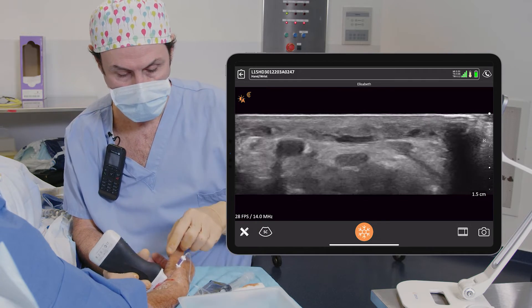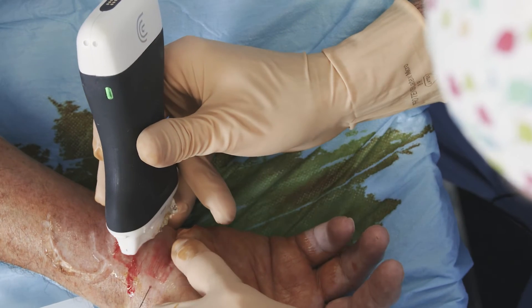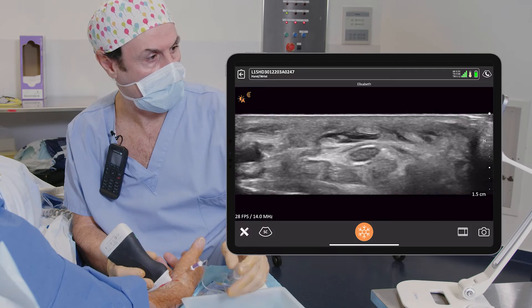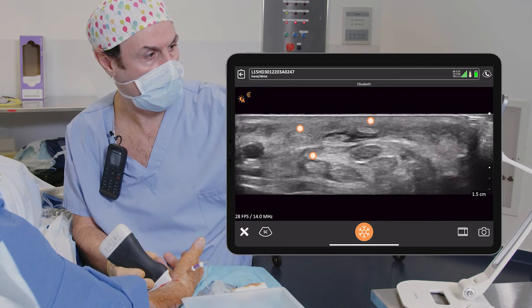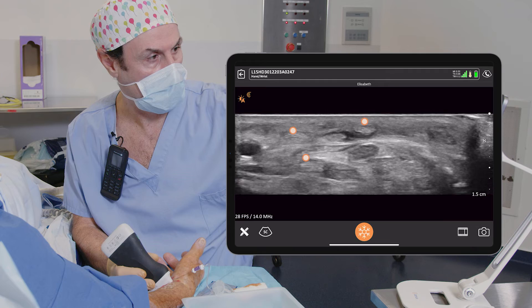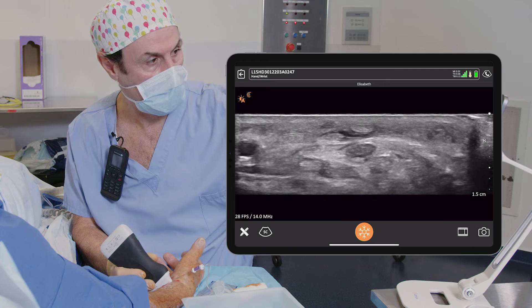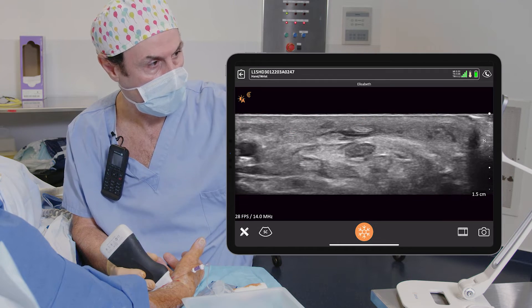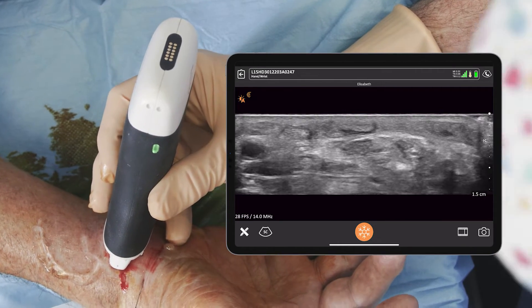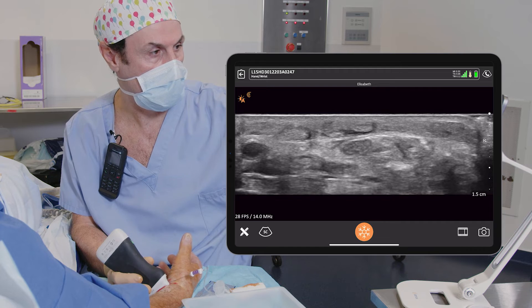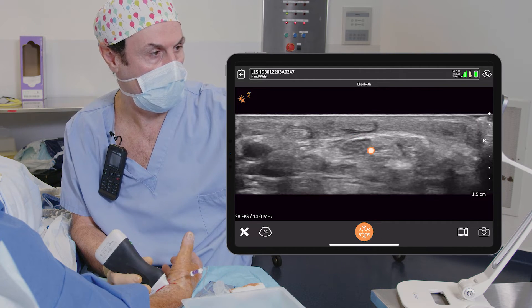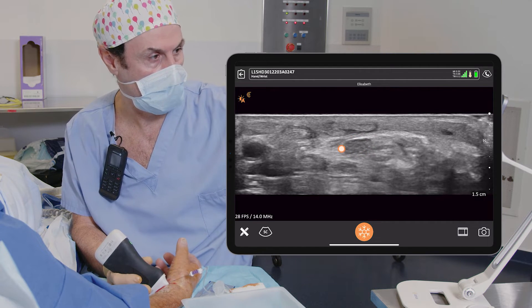So surgery will be here. We have tendons here — flexor tendons — and the nerve is up. So we see here tendons moving, and the nerve is up.